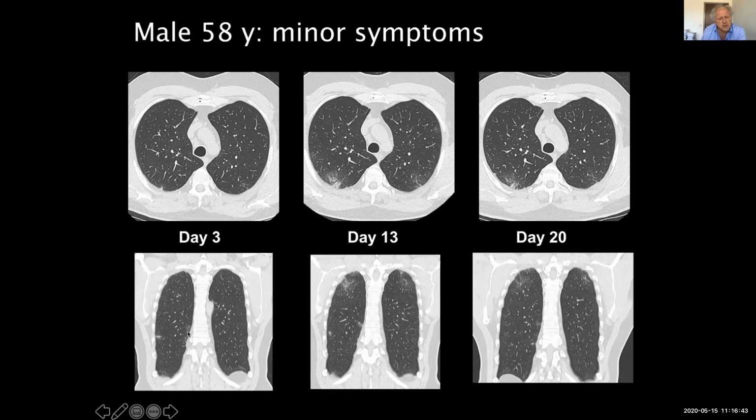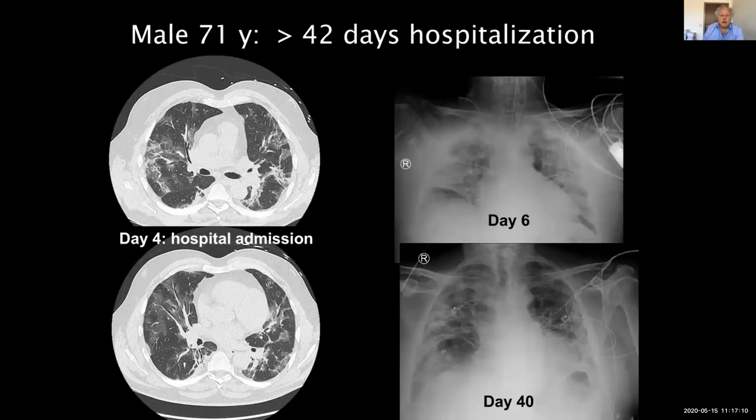And the first lesions you saw here and there, they have now disappeared, clearly, nearly completely. So this is an evolution, and it is quite a long evolution. The patient had only 7 days of symptoms, and still 2 weeks after the symptoms disappeared, you still see the lung lesions which stay there, and probably even with minor symptoms, you see that the lungs are hit really hard by this virus.